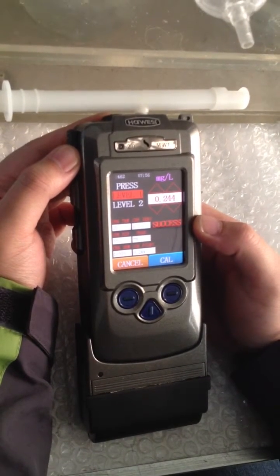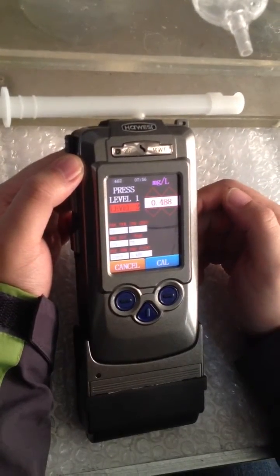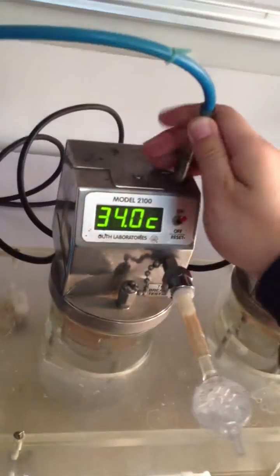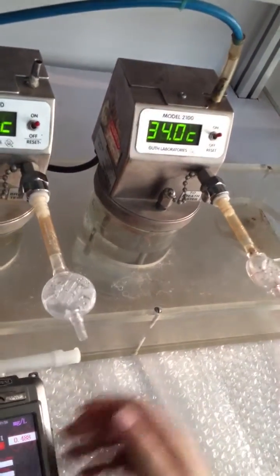Let's do the second one. Press Level 2. I also need to do some preparation work. We switch the mouthpiece to the second monitor.